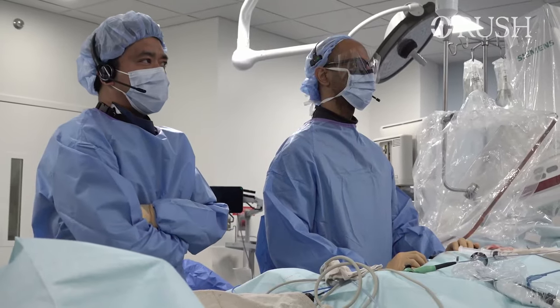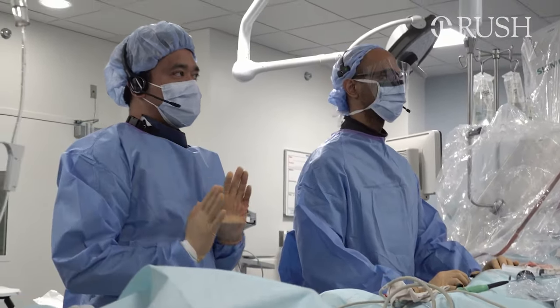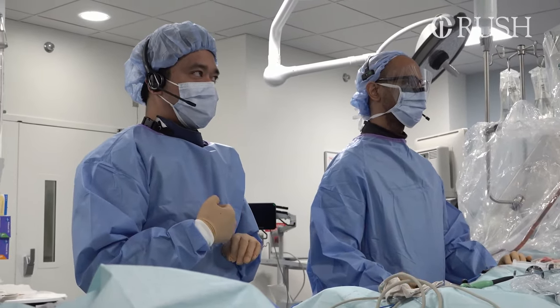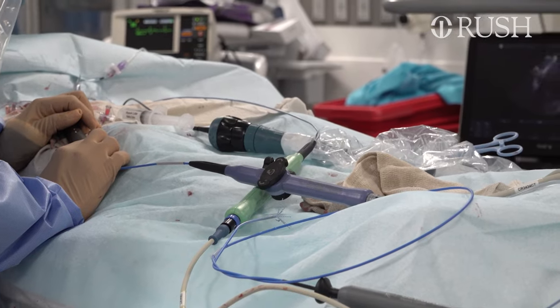And the reason I'm asking about the temperature is the esophagus is very close to the back of the heart. If the temperature in the esophagus goes up, then we have to be more careful, potentially stop ablating.